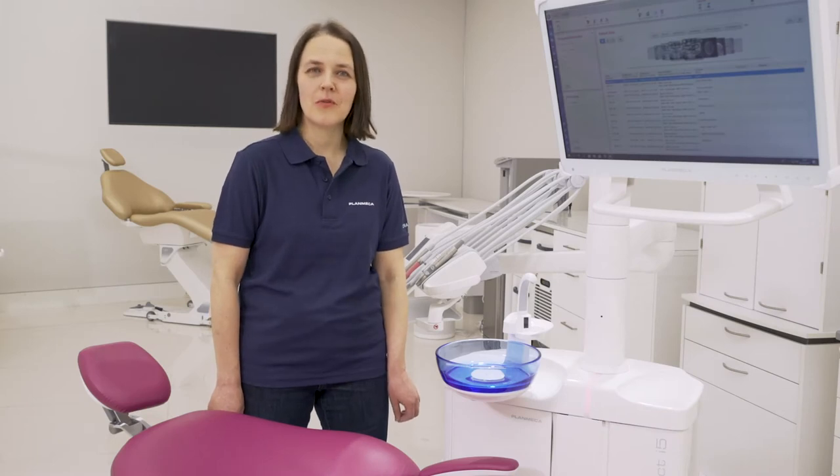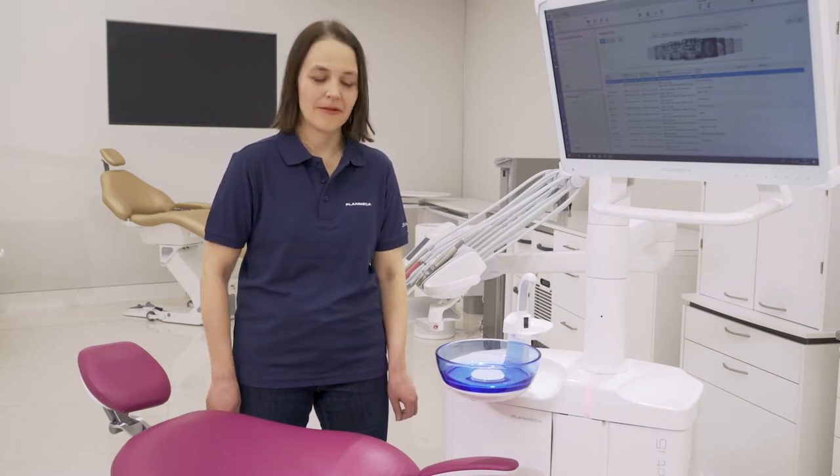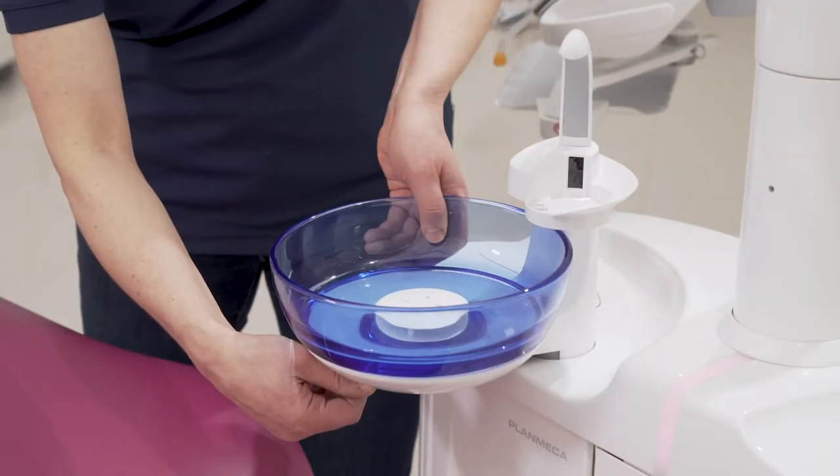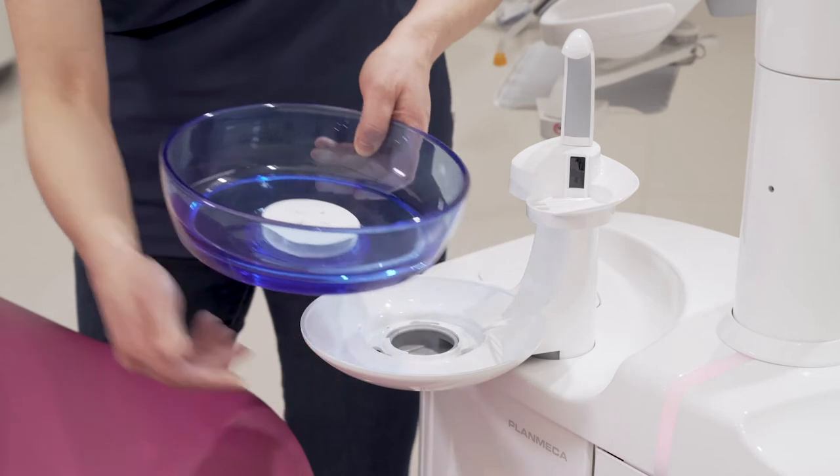If you want, you can remove the bowl for easier cleaning. Press the clip downwards, rotate the bowl a little bit and then lift it up.